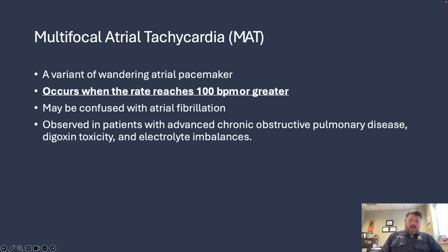So multifocal atrial tachycardia is a rapid supraventricular tachycardia that is caused by at least 3 different ectopic atrial pacemakers. The rate is usually between 100 to 150 beats per minute. However, sometimes rates as high as 250 beats per minute can occur.